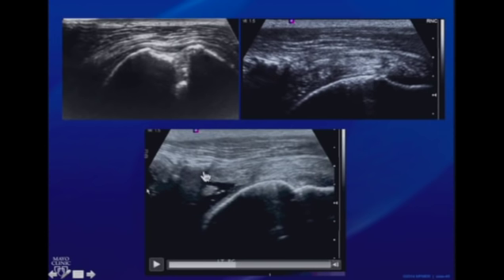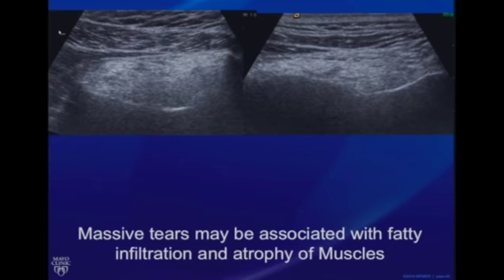So what happened here is that this is a non-insertional tear. The tear has taken place at the myotendinous junction. The suture material and the anchors which are holding the repair are intact. However, this patient returned with a new tear at the myotendinous junction. One of the reasons that can happen is if before the surgery, the patient did not have a good structure of the muscles themselves. That is why we look at all the muscles.